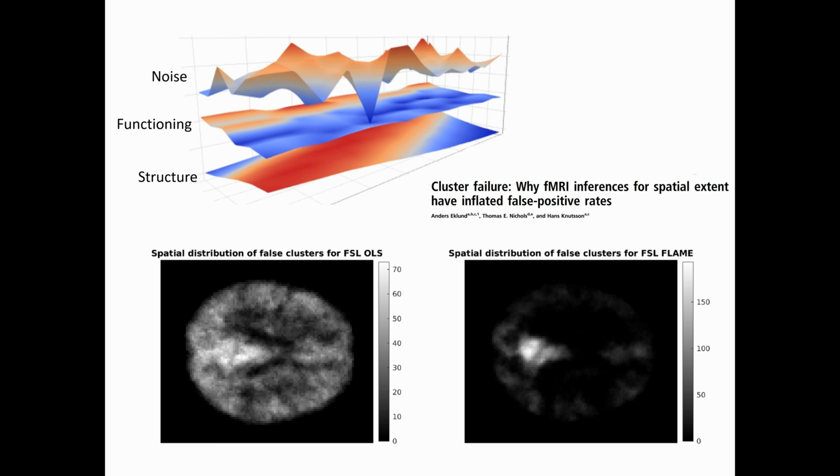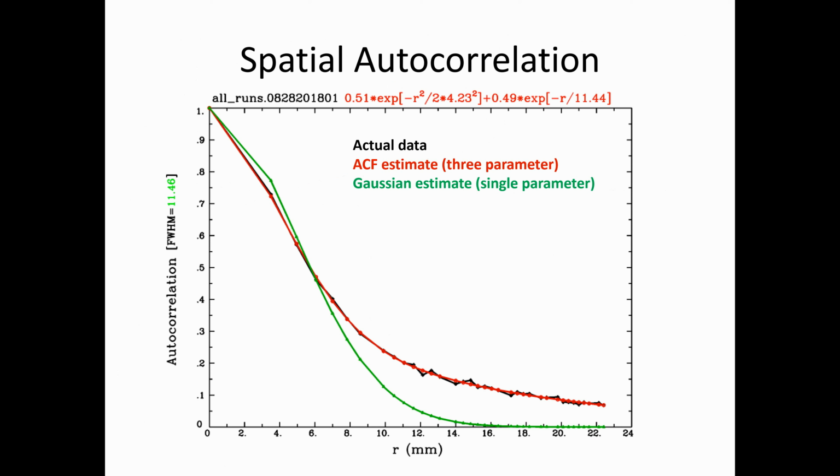And when you talk about a lot of these corrections, they don't take the specific region and the aspects of the region into account as well as they should. One of the main concerns is that when you do random field theory or any of this, you blur your data. This can be very helpful in controlling for adjacent noise at a scale and giving you a clearer picture of what your underlying data is and giving you something to pull out.